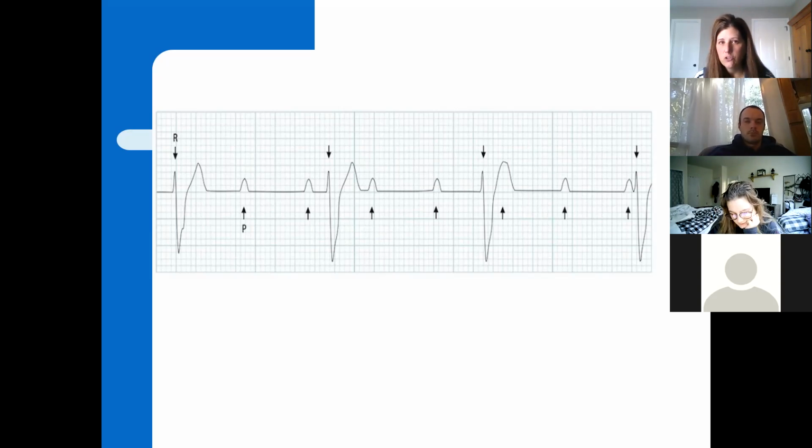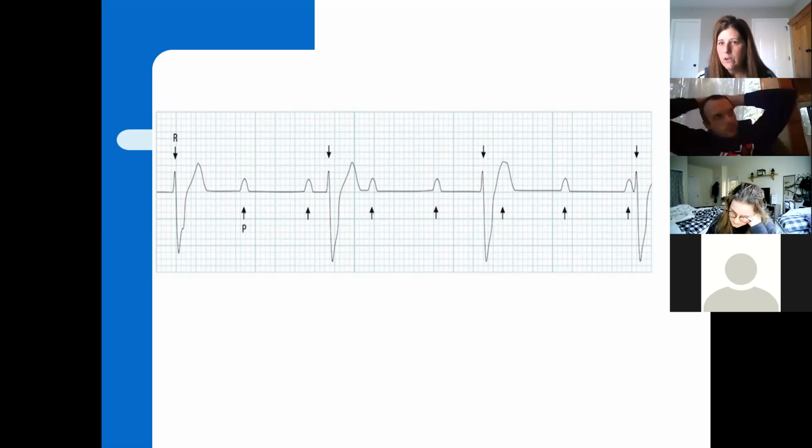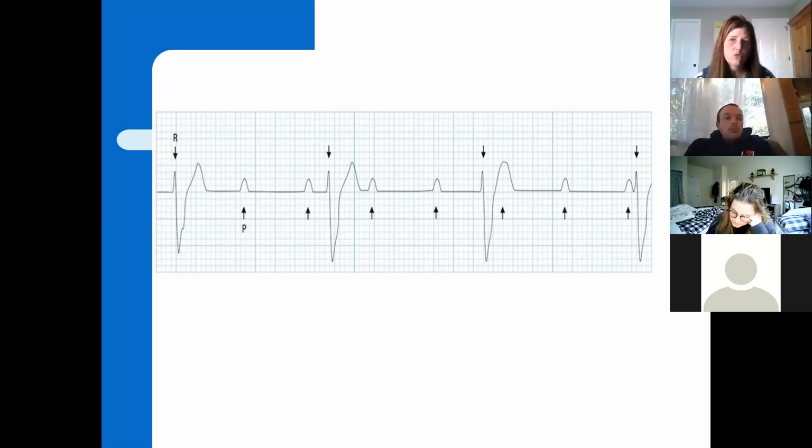I may have said that yesterday. There's a lot of times that people say, I can't figure this out on my weekly math EKG sheet. Do the best that you can do. I still think if you go through the steps, you'll be able to figure it out. But on the test, it's going to be very obvious to you. It's going to be easy to count. It's going to be clear enough for you to count and figure out what your measurements are. So don't let that stress you out.